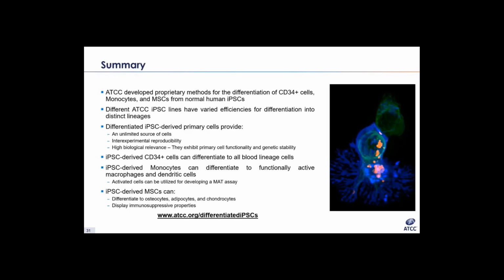So I actually haven't looked at every single experiment that ATCC R&D did, but what I can tell you is that the iPSC-derived mesenchymal stem cells that came from iPSCs originally were developed from bone marrow CD34 positive cells. And basically, we just selected them for the best overall performance, what performed the best across the board.